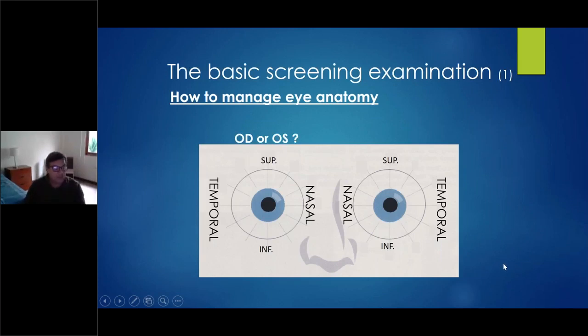This is so easy when you are in front of, facing the patient. Some people make the ultrasound examination in the opposite position. You are at the head, and the patient lies down with the feet just in front of you.